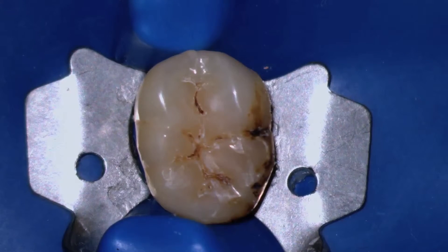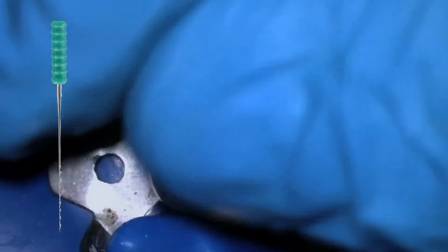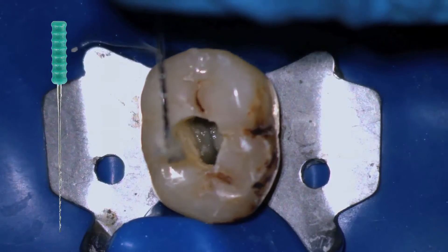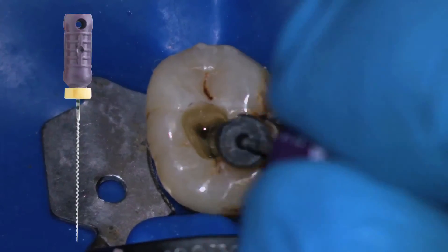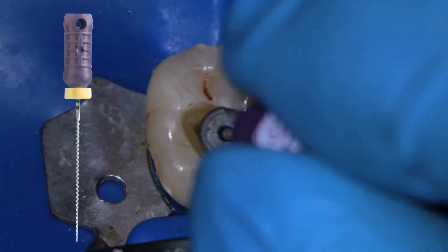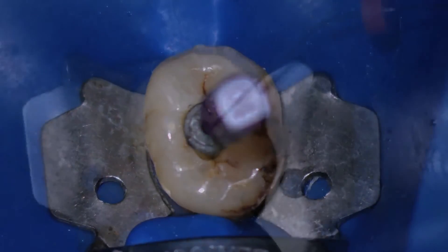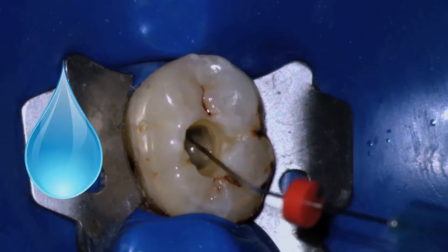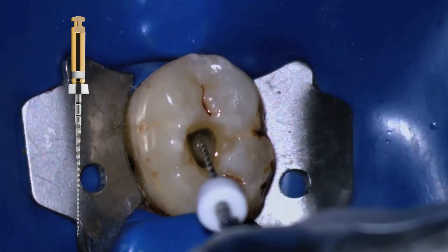Now we are going to see this lower molar treated with WaveOne Gold. Here we have the tooth that has been determined to require root canal therapy and is restorable. We perform the access opening, remove the contents of the pulp chamber, and ascertain that the canals are patent with a very small file. You can see the flooded pulp chamber. Once we establish patency, we create the glide path with the ProGlider rotary instrument. The pulp chamber must always be flooded with sodium hypochlorite. After establishing working length, we create the glide path.